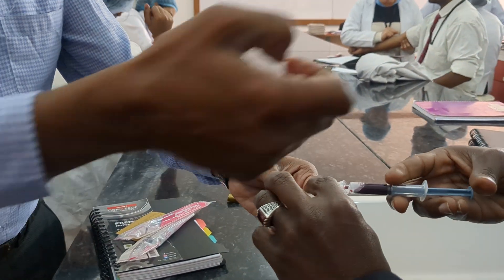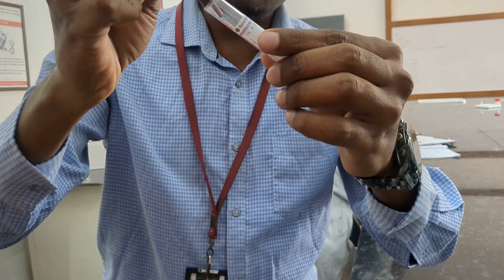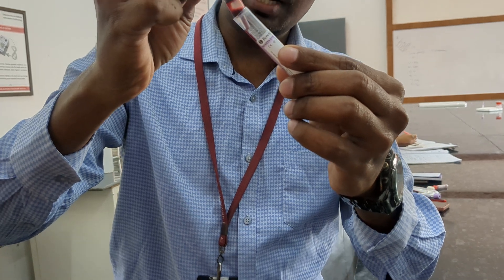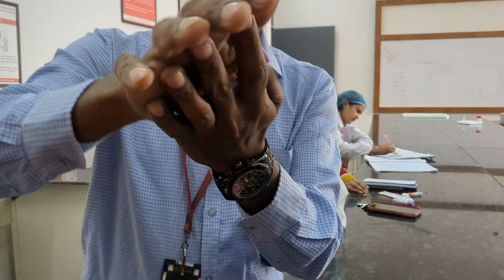When collecting, you need to draw the blood slantly into the tube so that hemolysis won't happen. Collect the blood slantly, then keep the cap on and mix it well.